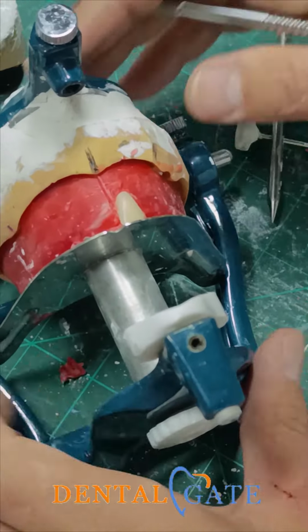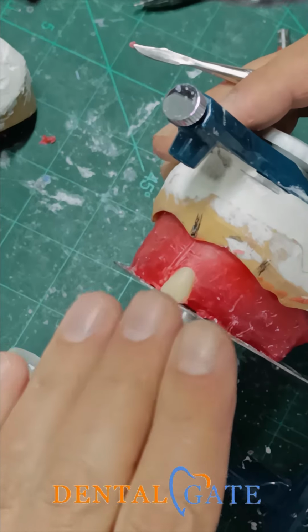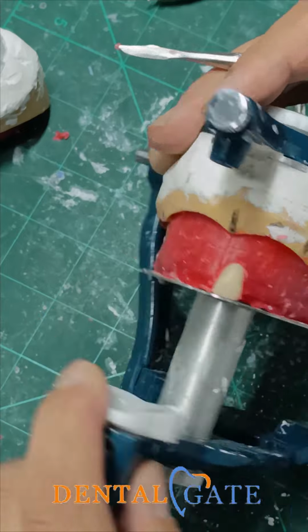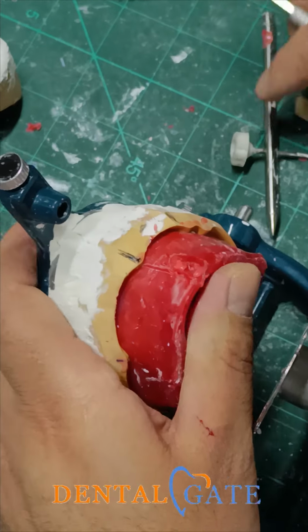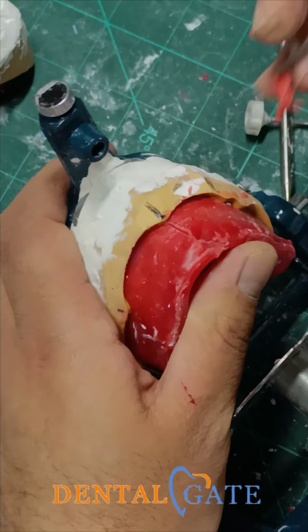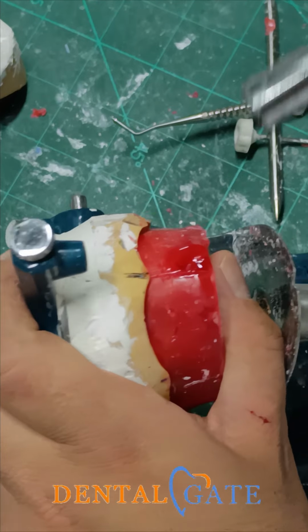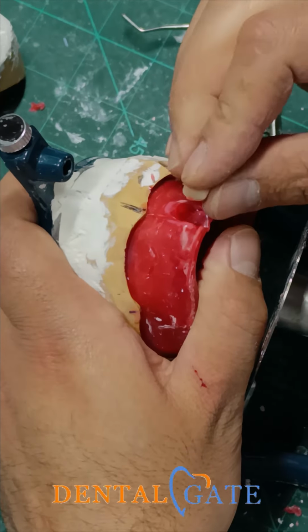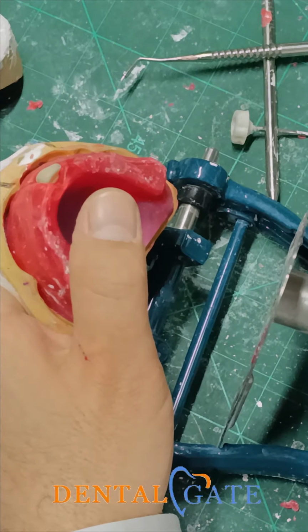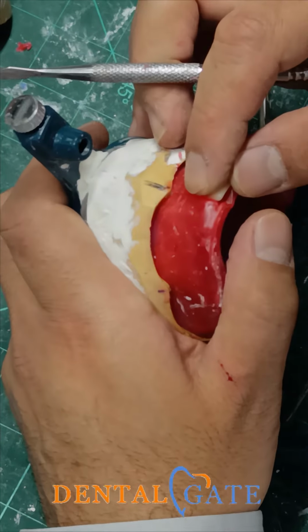There is a mistake now, because my aspiration is that the central incisor should be what? It should be protruded labially to support the lip, to simulate the shape of the wax, okay? So remove a sufficient amount of wax and prepare the socket for the central incisor and put it in this shape. You can see it will be within the level of the bite. Within the level of the bite, okay?